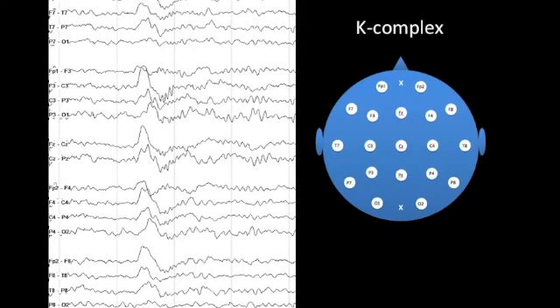One example would be this normal K complex during sleep. Again, I have shown it in an anterior-posterior bipolar montage. You can see that this K complex has a very broad field extending throughout much of the anterior aspect of the head. Let's say that the field involves this general area and is approximately maximal in the frontal central region of the head.